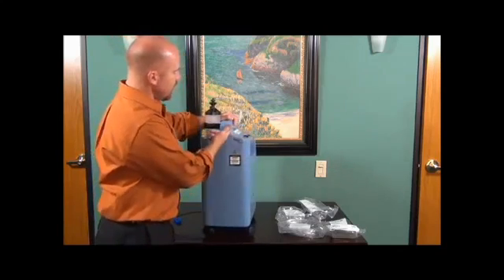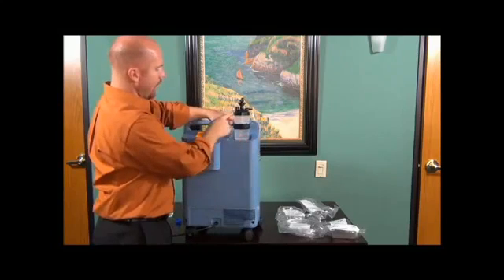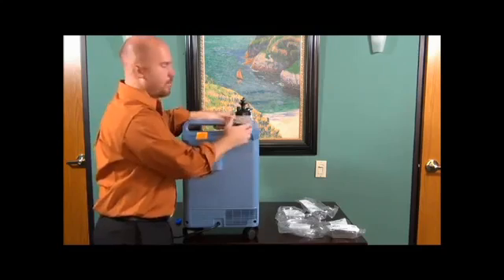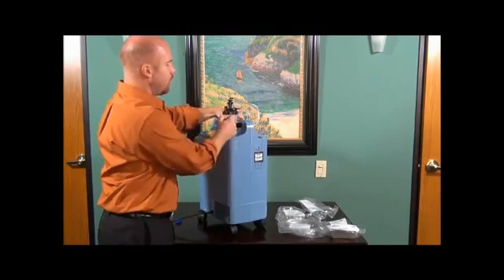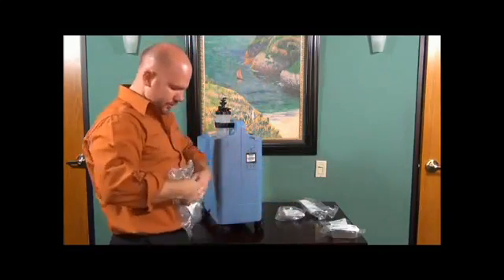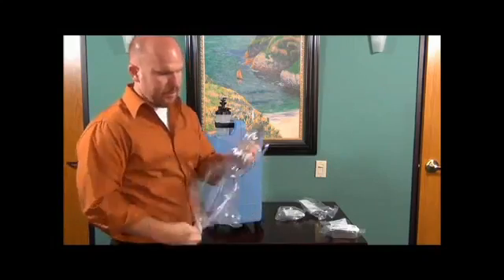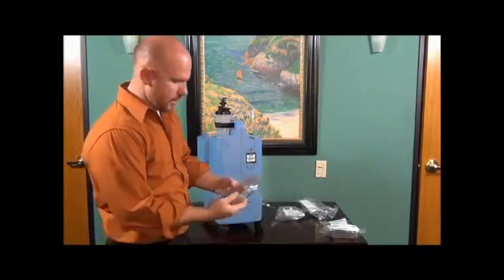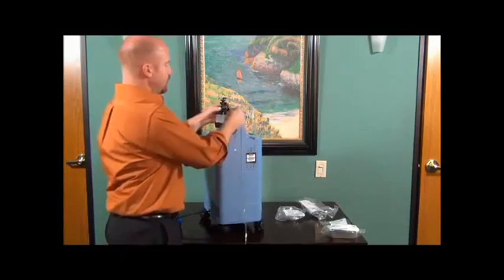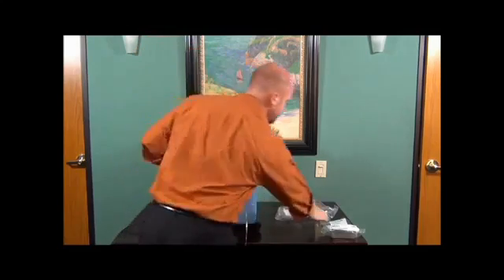And the way it works is oxygen comes out of the port, comes right into the humidifier bottle, the air passes through the water, causing the oxygen to be moist when it comes out of this port where you plug in your hose. So we'll plug in our hose. Here's our 25-foot tubing. Some of you might use 50-foot. It doesn't matter. For this purpose, we're just going to use 25. Your 25-foot tube plugs in right here to this port on the humidifier bottle.